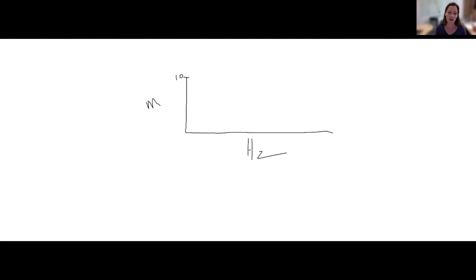Basically, you just imagine that you have reconstructed the original signal with sine waves of various frequencies. You can plot the original data using that. You can actually do that on the original data and plot the results, which we can maybe work up to. But hypothetically, you can do that for any signal.